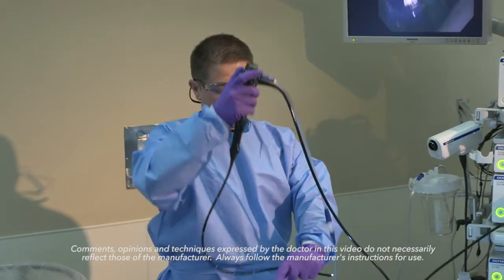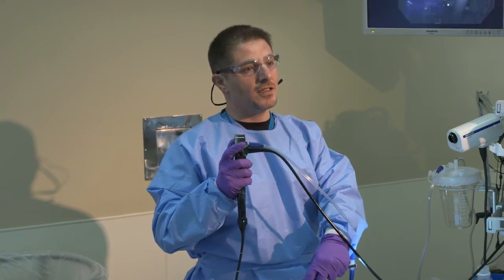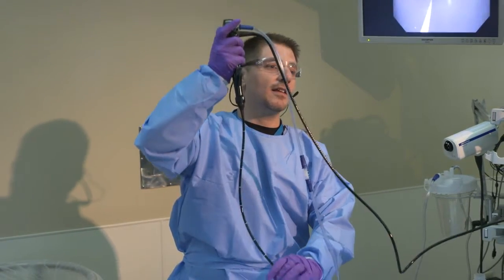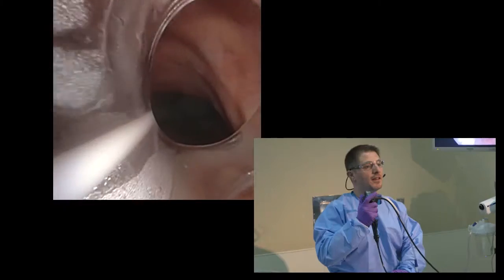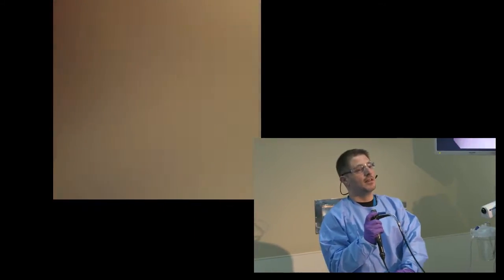So we're doing bronchoscopy for a patient 79 years old with a right upper lobe lesion. We're starting with mediastinal staging for all lymph nodes, starting from the left side going to the right side. All bronchoscopy starts with airway examination first to guarantee there's no endobronchial lesions. We examine the airways and take baseline pictures for all the airways and clean the airways from mucus too.